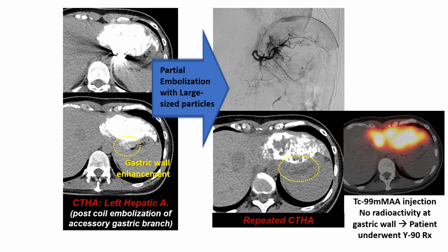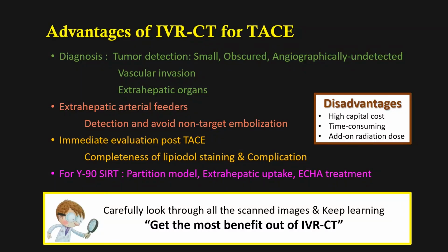In summary, the advantages of IVR-CT are extraordinary, but they come with the price of high capital cost, being time-consuming, and add-on radiation dose to the patient. So you have to look through all scan images carefully and keep learning to get the most benefit out of the IVR-CT. Thank you for your attention.